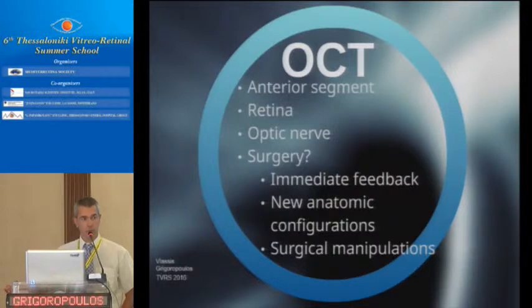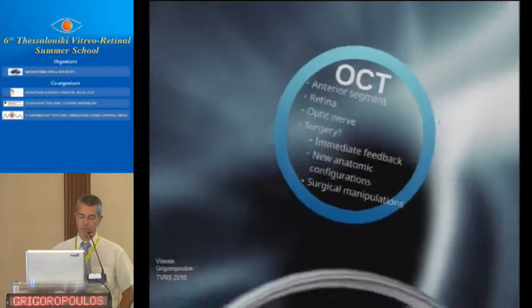It would be useful to use it for surgery because, for example, you could have immediate feedback during surgery of what you're doing on the retina. You could be aware of new anatomic configurations that are happening during surgery. Or you could change or improve your surgical manipulations if you were able to use it during surgery.